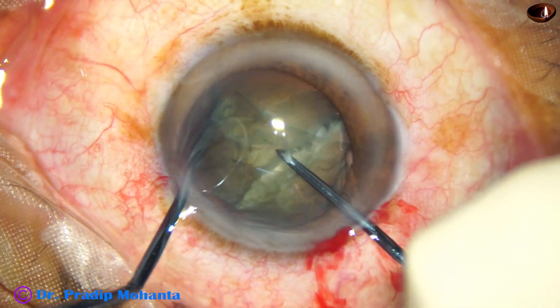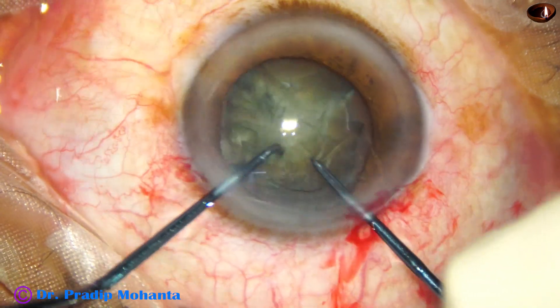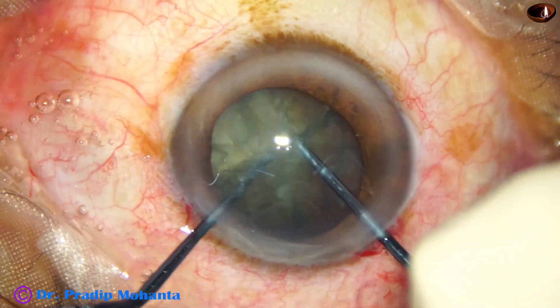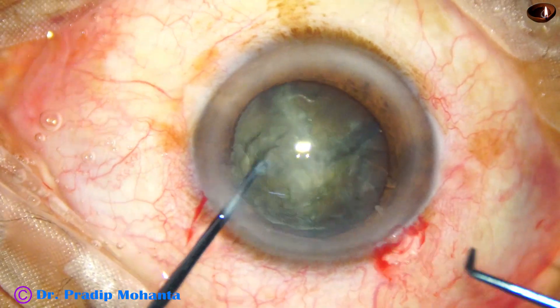See how quickly we have divided the nucleus into three pieces. Now the other hemi-nucleus is also divided and we get four pieces.